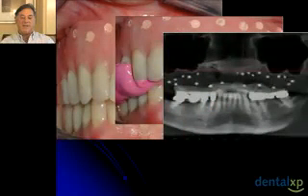This is the image off of the cone beam, and you see that certainly the little white dots or the markers are easily visible. The software will look for 4 markers to pair up with the template alone, and it'll easily be marked in this case.